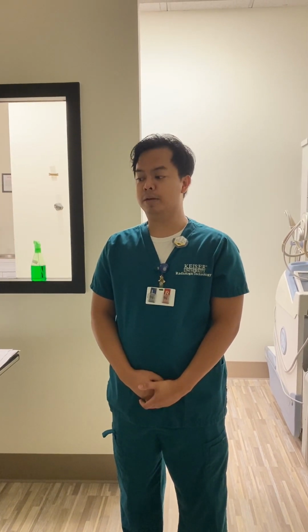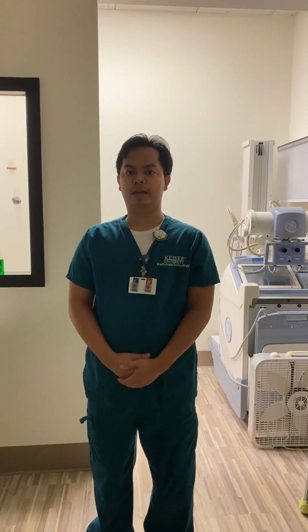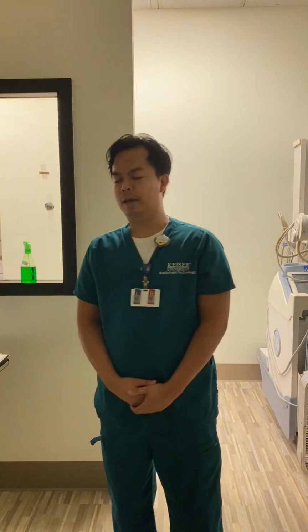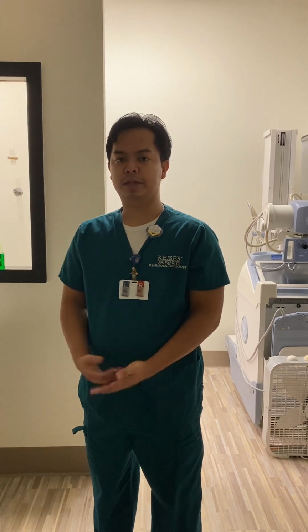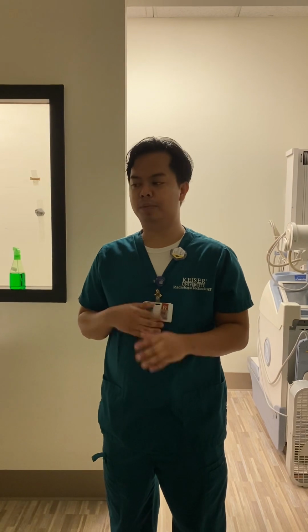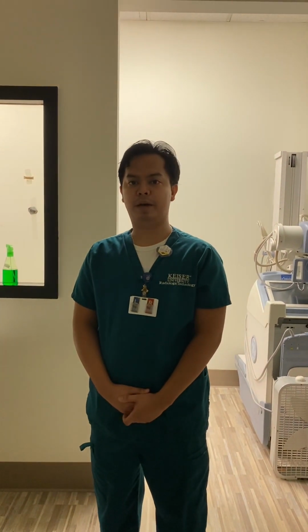The other main important thing is to ask if they're a smoker, if they have smoked, and how much and what they smoke specifically. Once you have that, you're basically ready. You will ask the patient to go to the changing room and change into a gown. Make sure you remove everything from the waist up, including jewelry, bras, anything that might obscure any anatomy or show artifacts on the x-ray.